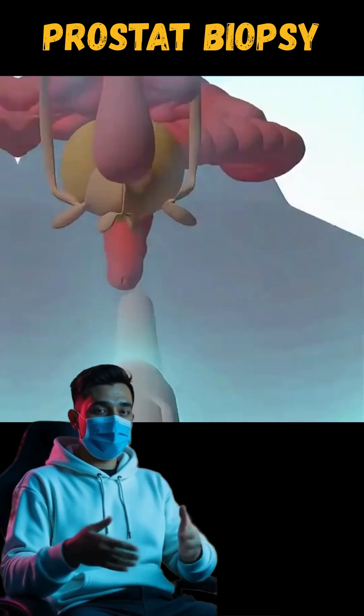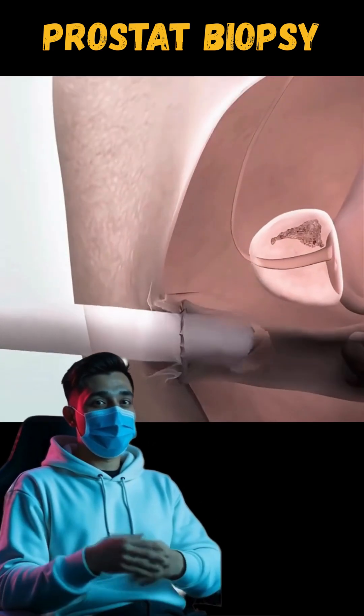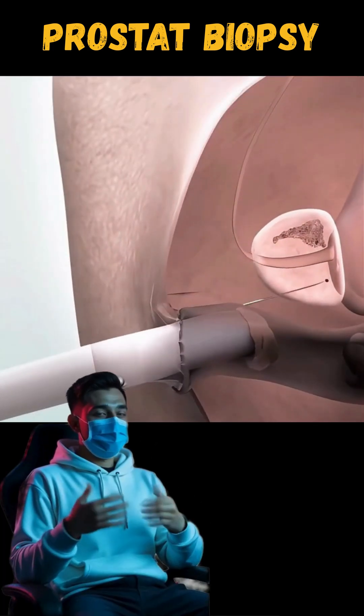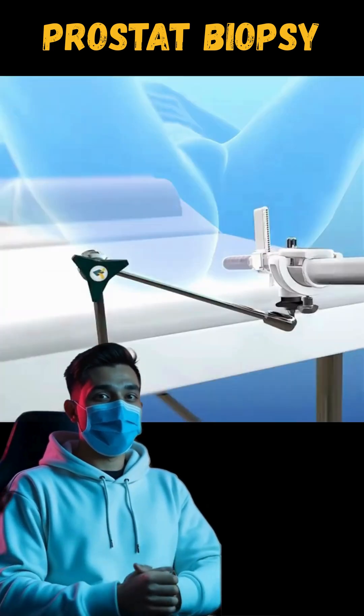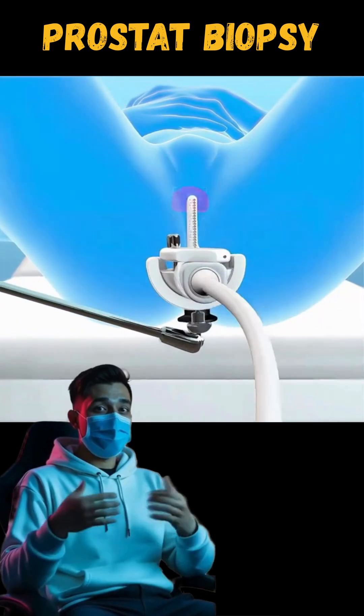Ever wondered how a prostate biopsy is performed? This quick procedure helps detect prostate issues, including cancer. It starts with the patient under general anesthesia, ensuring they are asleep and comfortable.